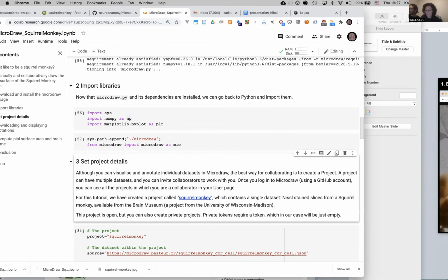Trisana was asking if there's a limitation on the size of the images. There's no limitation. We even have one slice of the BigBrain at 1 micron online that you can go and check. So it's just a matter of storing it, but you can even browse those images on a phone or a tablet.